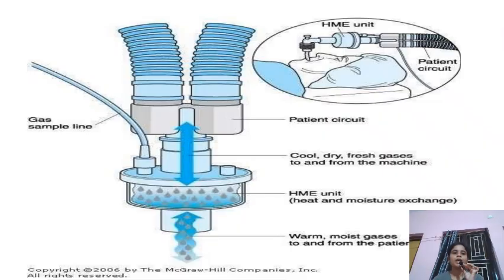And here, if extra gas, like oxygen, has to be given, it can also be given through this port, or any monitoring like EtCO2 monitoring can also be done through this port.